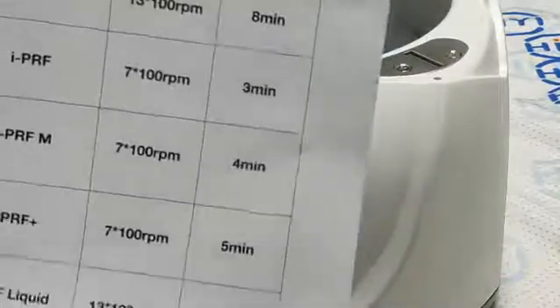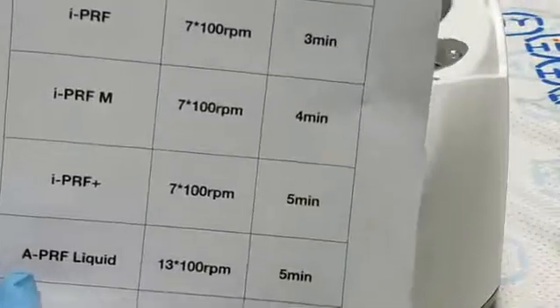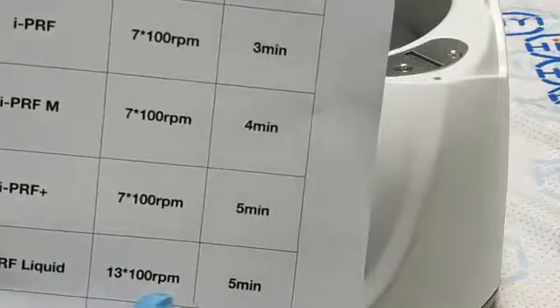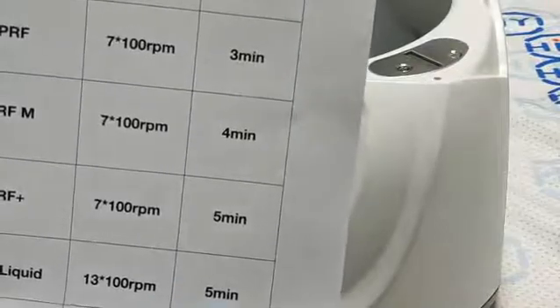The next one is program 5. It's APRF. The speed is 1300 rpm and time is 5 minutes.